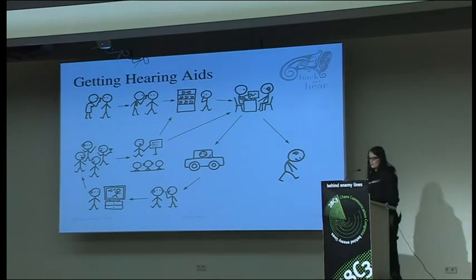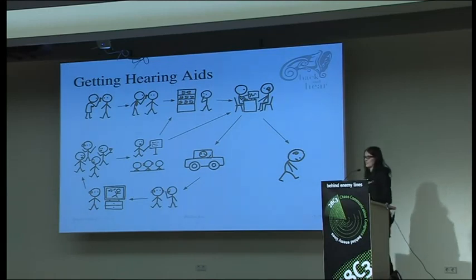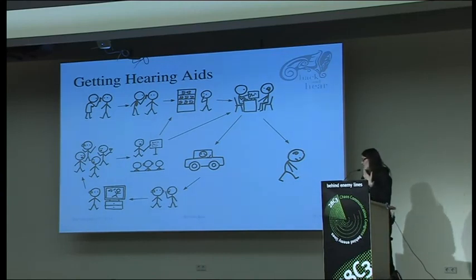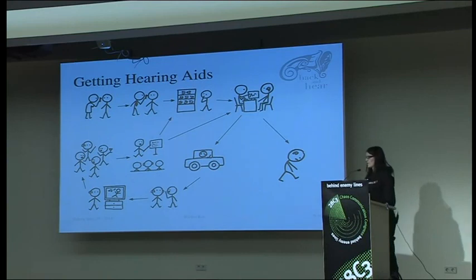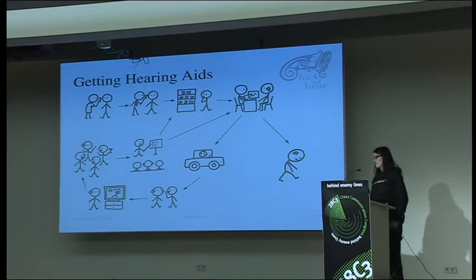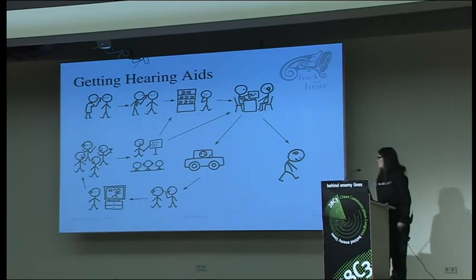You have to go through all the difficult hearing situations to test if it works with that tuned hearing aid. So you drive a car, you listen to music or other people in the car, you try to have someone whisper something in your ear, you listen to the TV, or you go to a party where a lot of people are talking to each other and you have to make out the person that's talking directly to you. Or you listen to a talk like that where the speaker is actually quite far away from your hearing aids.